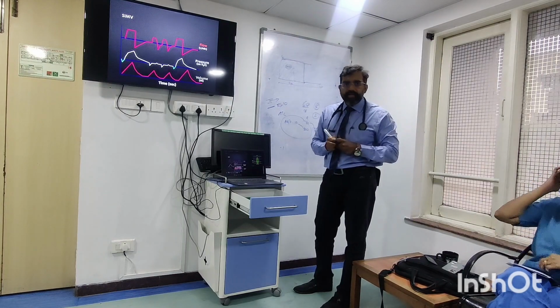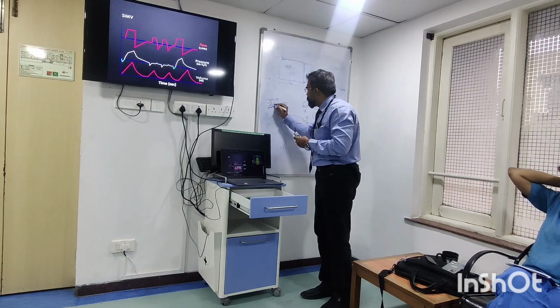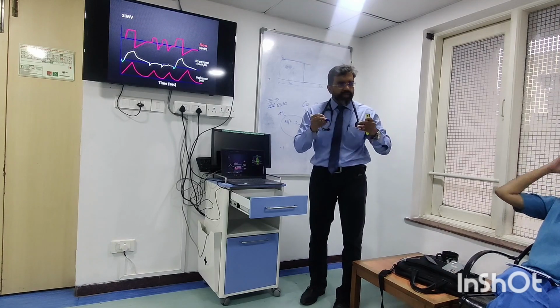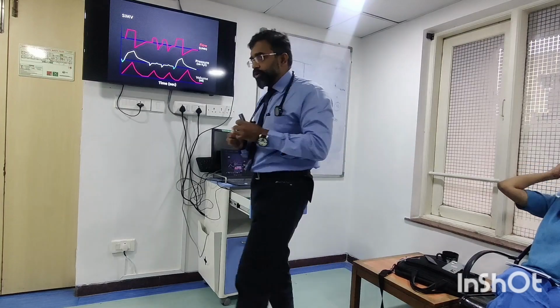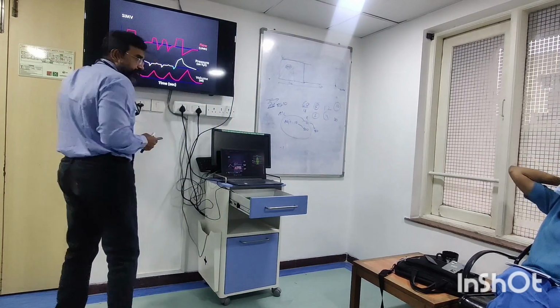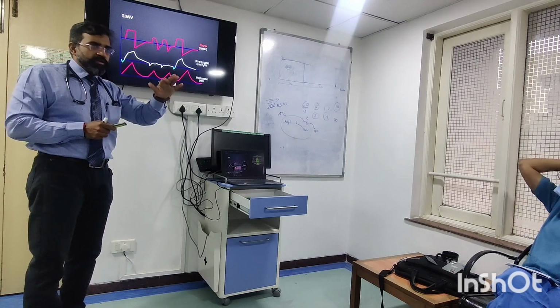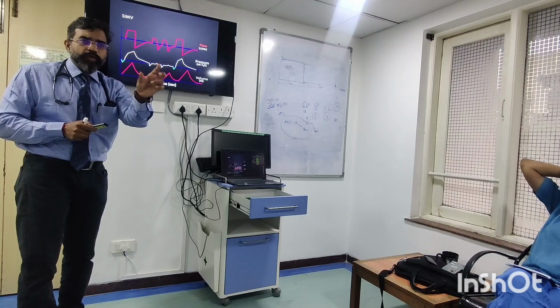Now what they did was put one phase in the middle, somewhere in the middle, where whatever the patient is doing, the patient can do. That is the birth of SIMV, along with the trigger. So the trigger came first, then with the trigger they put a place where you could actually breathe in the middle.